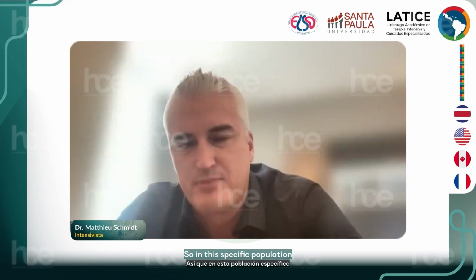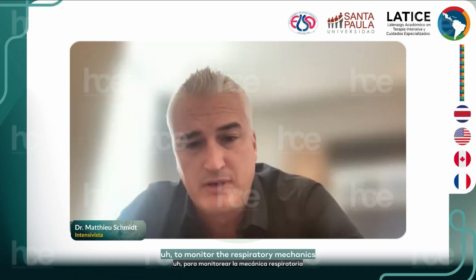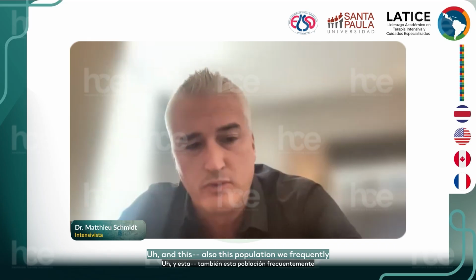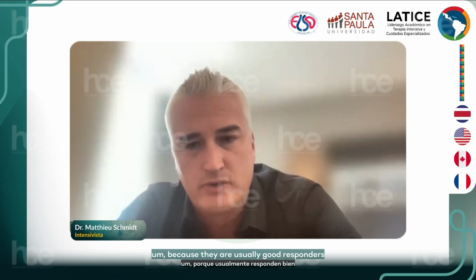So especially for very large BMI, we almost always try to use esophageal pressure to monitor the respiratory mechanics and to set the adequate PEEP, because having the right PEEP in this subpopulation is challenging, but quite important. In this population, we frequently use prone positioning before, but also during ECMO, because they are usually good responders.